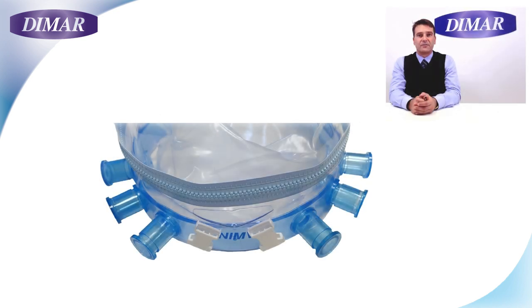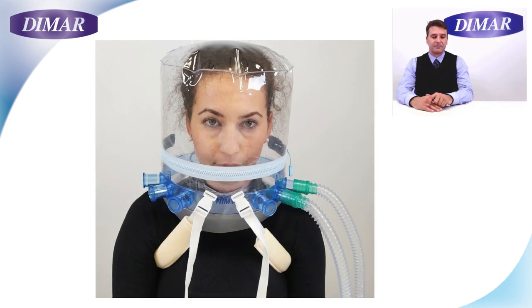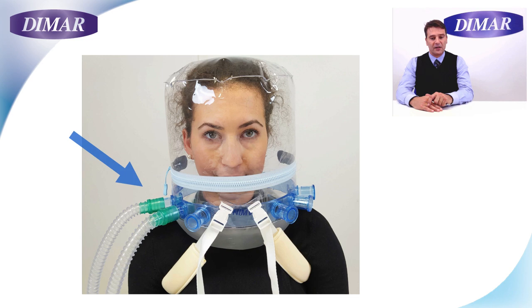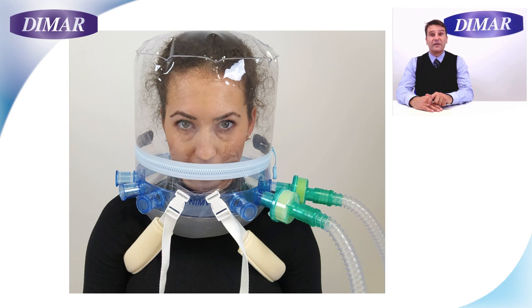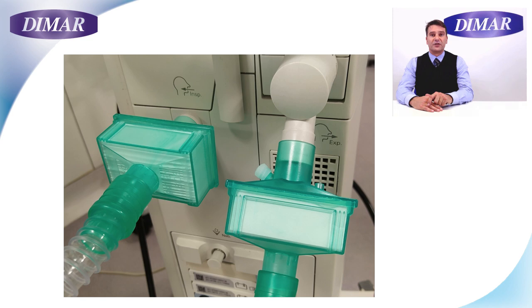Now let's see the connections. We have six connectors: two 22 male and one 22 female per each side. The reason why we have six connectors is to grant you the maximum flexibility accordingly with the possible settings. Additional filters can be interposed at the helmet side, but they are usually already positioned at the ventilator.